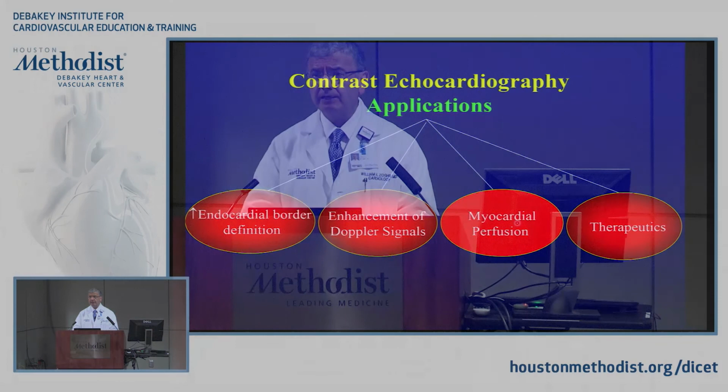And the other, myocardial perfusion, believe it or not, there is a code. We don't do myocardial perfusion because, I mean, we've worked 15 years or so on research in it, and it is very variable. I think it's tricky, and that's why you don't see it as well. It's still in research purposes. It's beautiful research, too, particularly in a best setting of like an animal setting, et cetera, because you could do multiple injections in different hemodynamic situations.